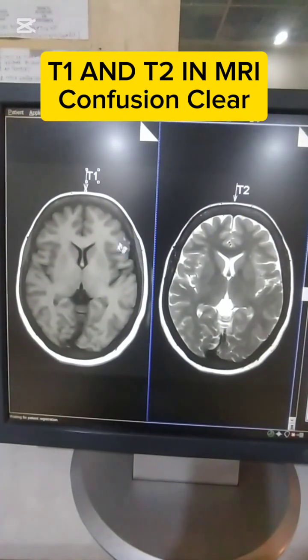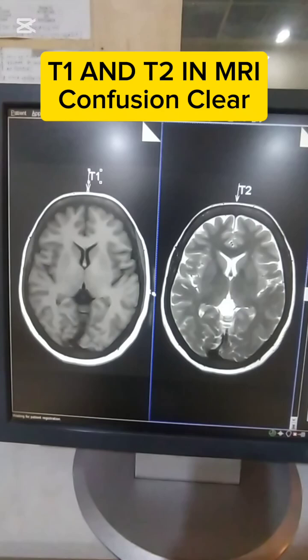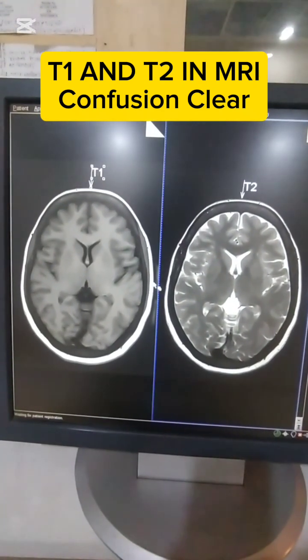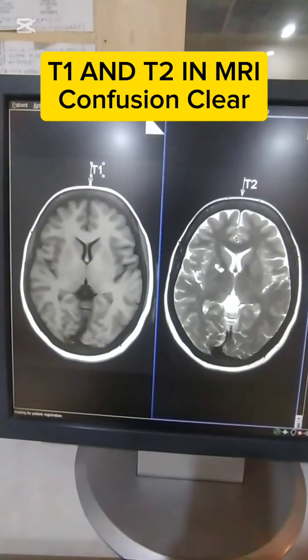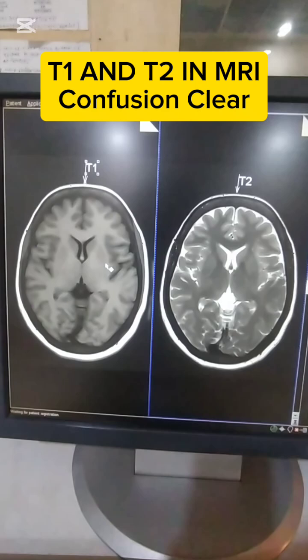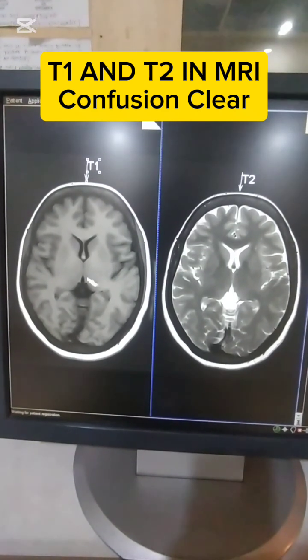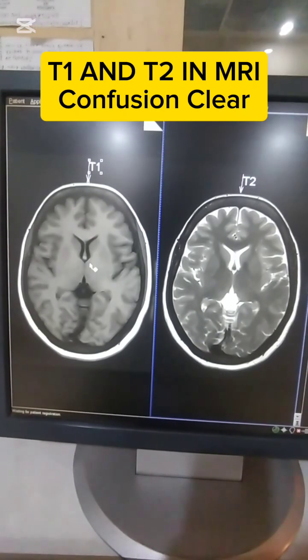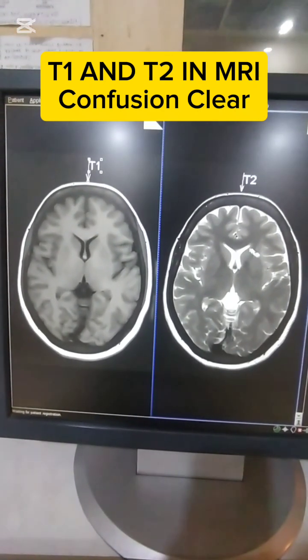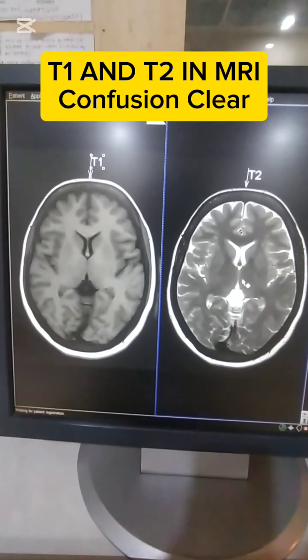Every tissue has T1 and T2 characteristics, or T1 and T2 timings. By using these timings of the tissues, the contrast difference is created in the image. By using the T1 timings, the T1 weighted image is obtained, and by using the T2 timings, or T2 characteristics of the tissues, we get the T2 images.